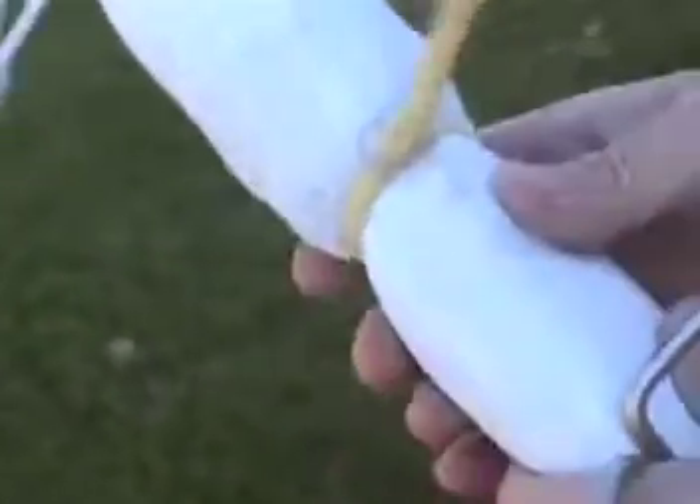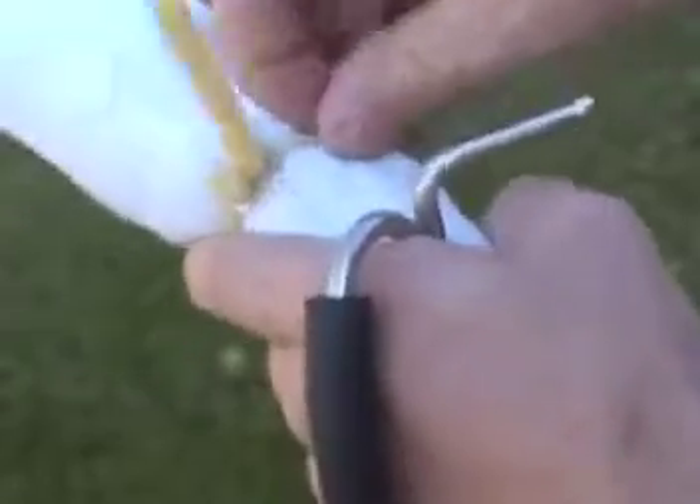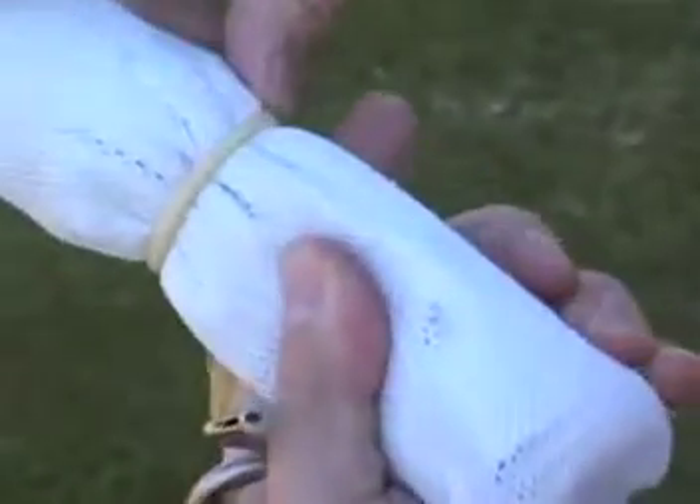Make sure that the band is tight. If you can't get your finger in under the band once it's on, you know you've got it tight enough. And it's evenly stretched all the way around the scrotal sac.